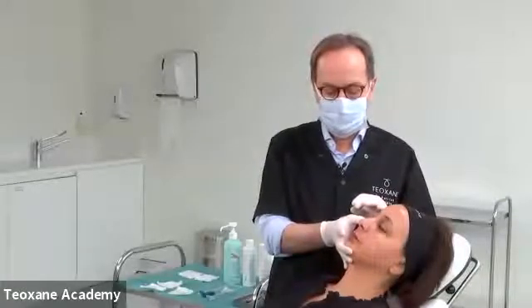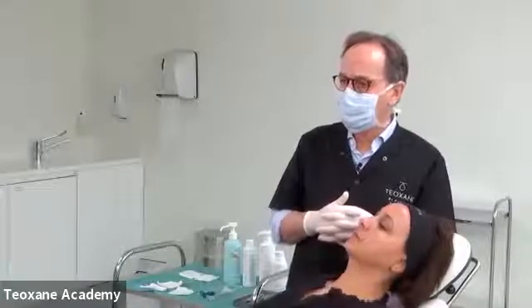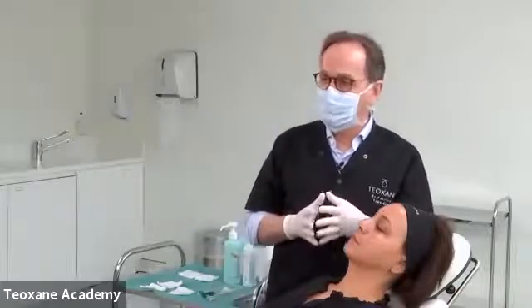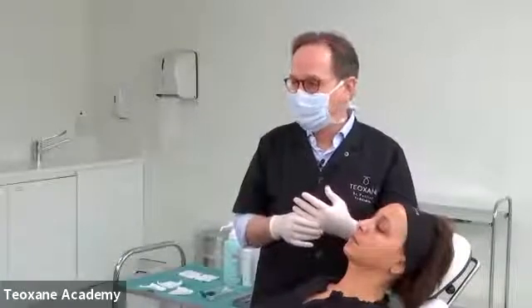We've got another one. Can we combine Redensity 2 deep with Redensity 1 superficially? Redensity 1 is a non-crosslinked HA, and because it's non-crosslinked, it has an action on the skin quality if you inject very superficially. So why not? It's a good idea to inject Redensity 1 superficially, but be very careful, because the skin of the eyelid is very thin, not to get bumps, because that is what you want to avoid.